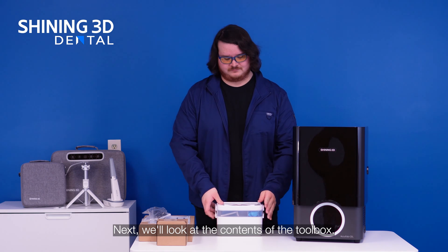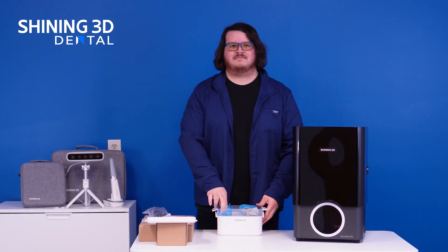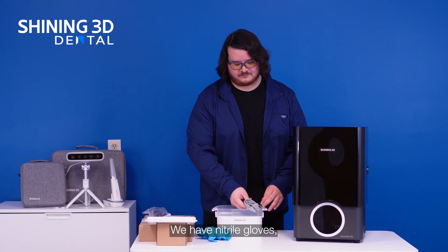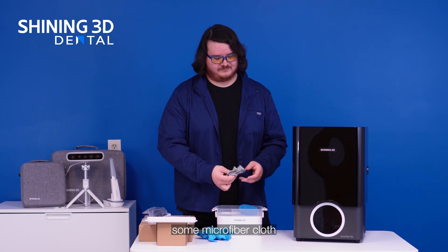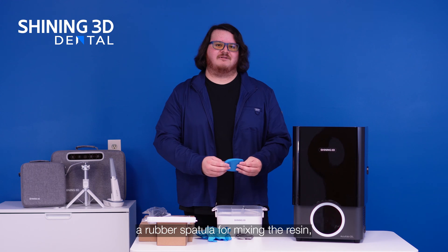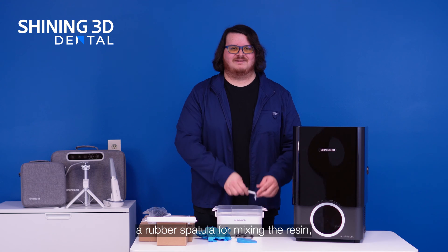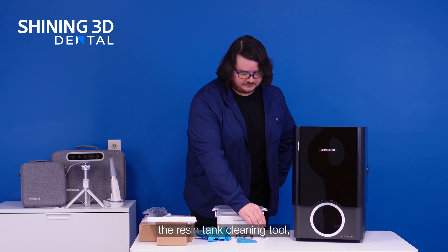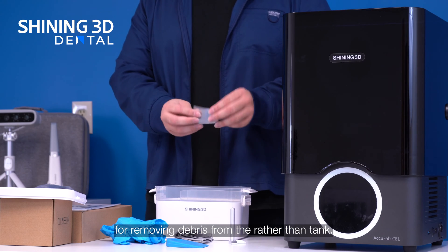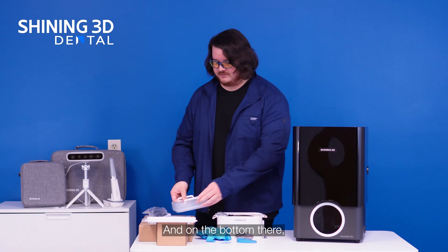Now let's look at the contents of the toolbox. We have nitrile gloves, some microfiber cloths for cleaning the LCD screen and the touch screen, a rubber spatula for mixing the resin, the resin tank cleaning tool, and some clear file for removing debris from the resin tank.